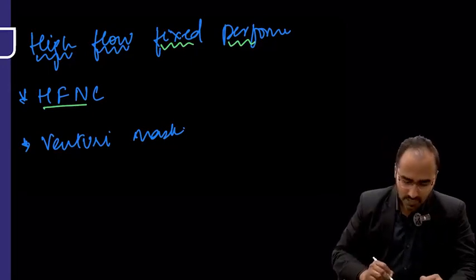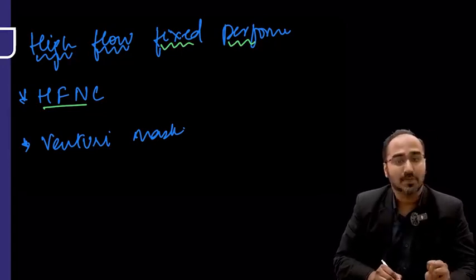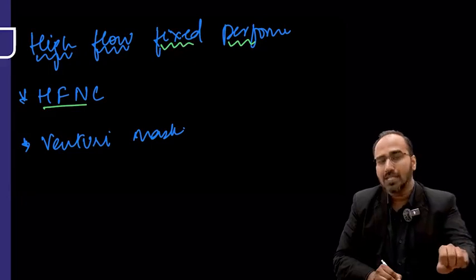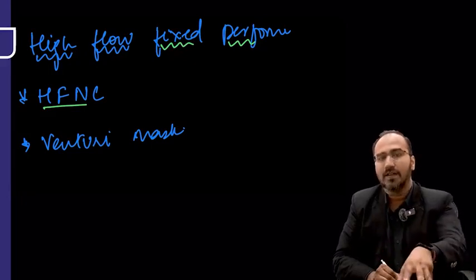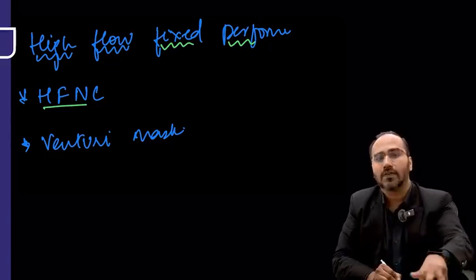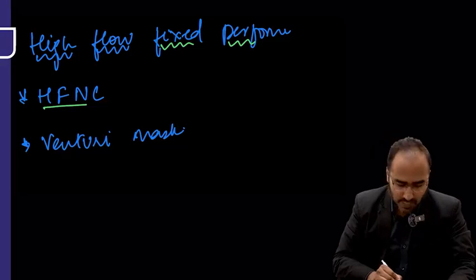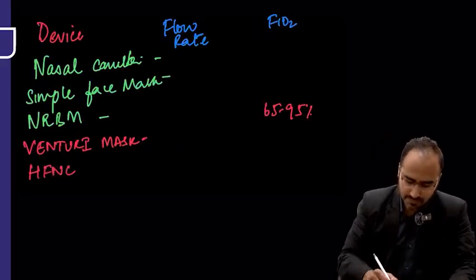Venturi mask. Now guys, what we need to remember, there have been questions asked about how much this oxygen delivery device will deliver, how much FiO2 or how many liters of oxygen can be delivered through this device and all. Okay, for that, just look over here guys.